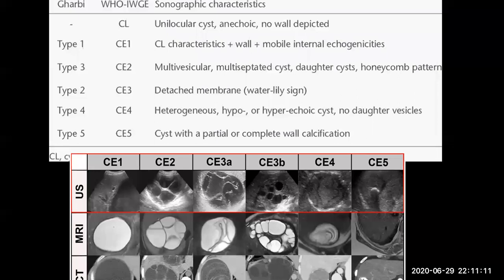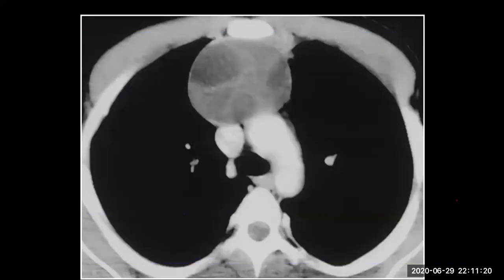This hydatid cyst is in the mediastinum or intrapulmonary? This case, yeah. Why? شو حكينا احنا هذيك المرة؟ How can we differentiate between mediastinal and pulmonary mass? How? According to the angle, it's obtuse angle.